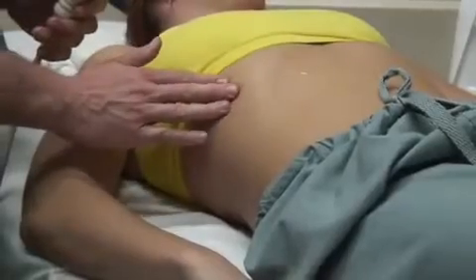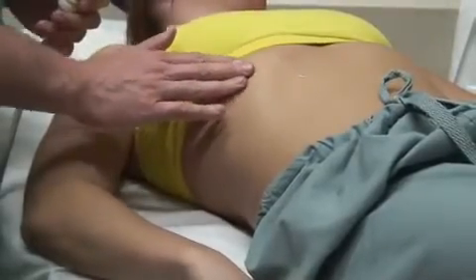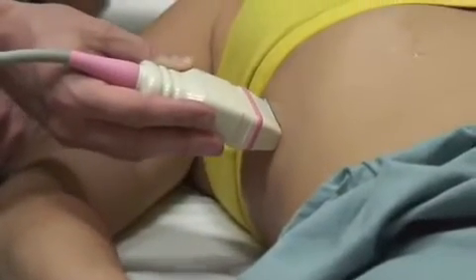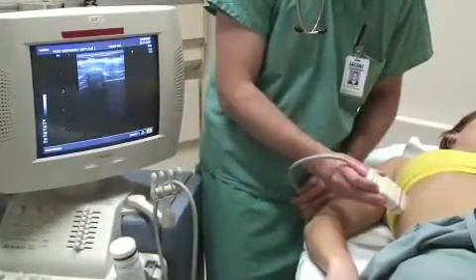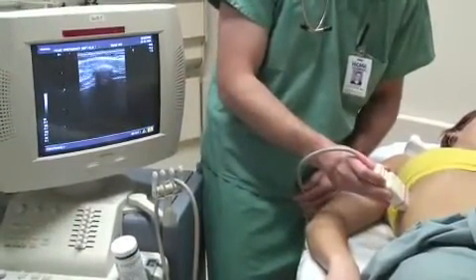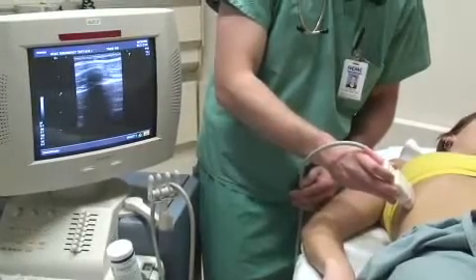The first step is to localize the area of maximal tenderness so as to focus your ultrasound exam. Using a high-frequency linear-array ultrasound transducer, start with the probe transverse to the length of the rib to obtain a cross-sectional view. Starting several inches away from the area of maximum tenderness, one can see how easy it is to trace the course of the rib.